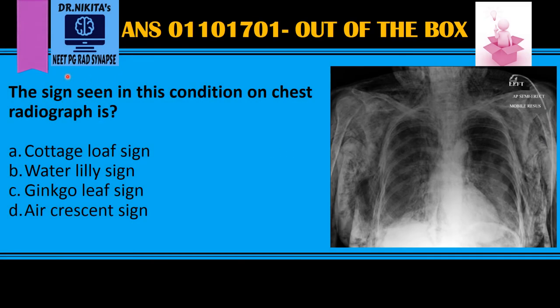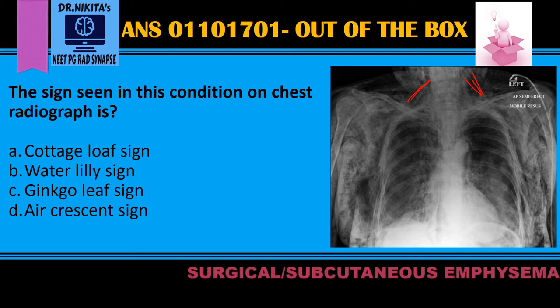We have been asked to identify the sign seen in this chest radiograph. What we see here are these abnormal black lines in the soft tissues. Everywhere in the soft tissues there are these abnormal black lines. We know that black on a chest X-ray means air. So basically there is air in the soft tissues — that is why the diagnosis becomes surgical or subcutaneous emphysema.